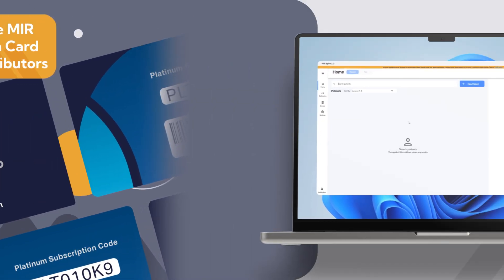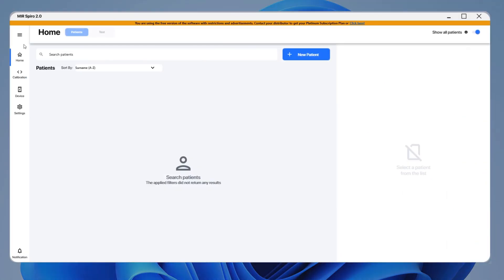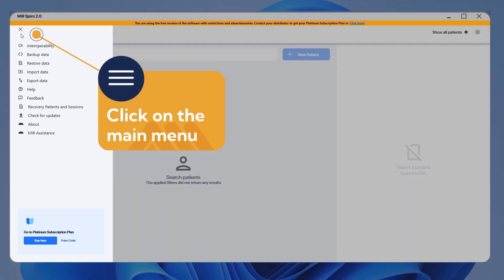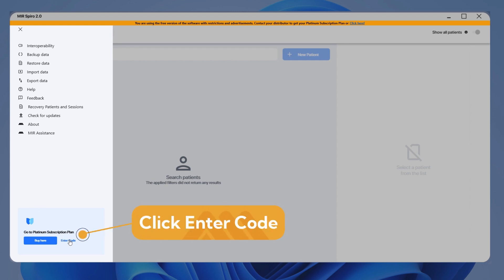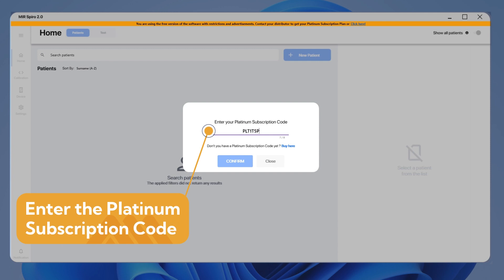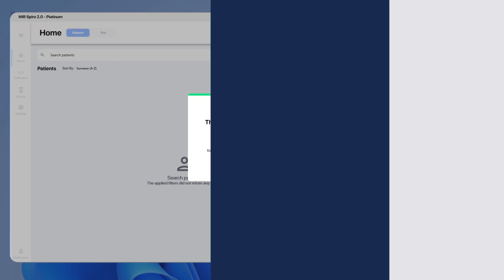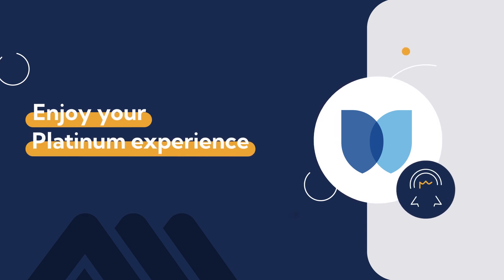Once you have the Platinum Subscription Code, open MIR Spiro Software. Click on the main menu and then select the option at the bottom right: Enter Code. Then enter the Platinum Subscription Code and enjoy your Platinum Experience.